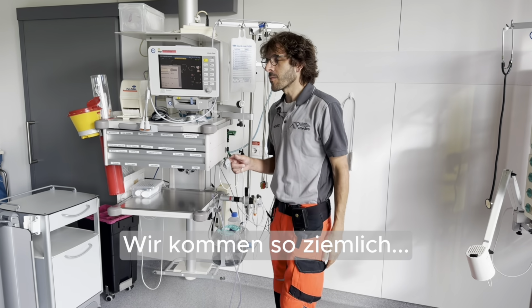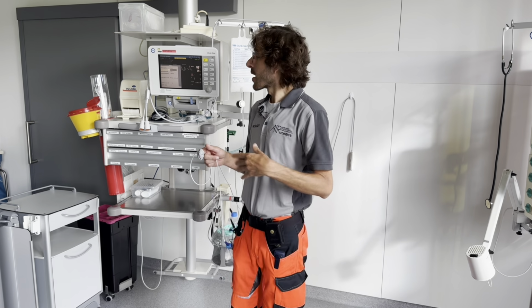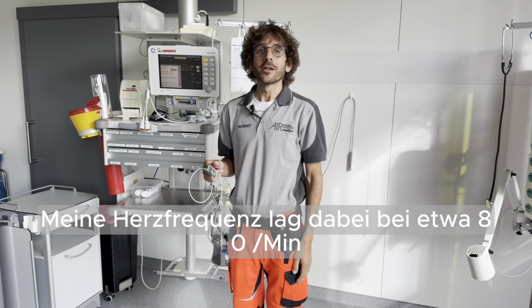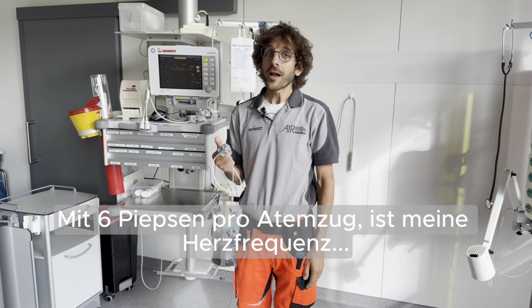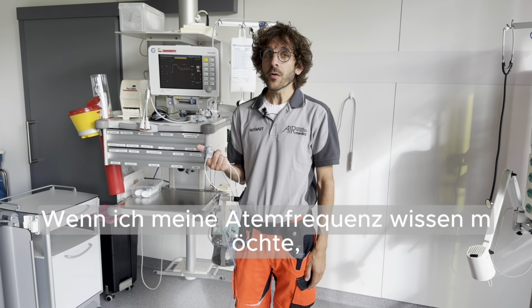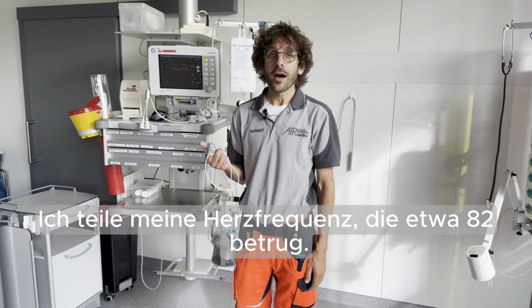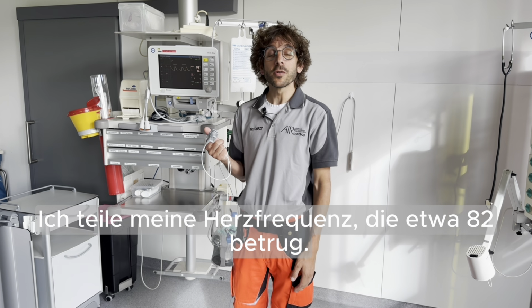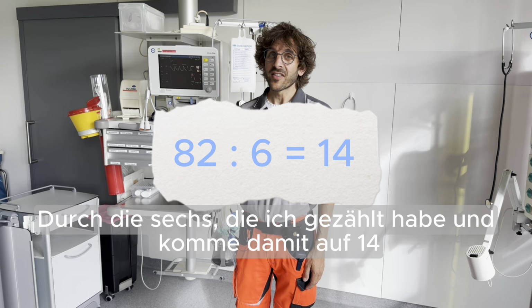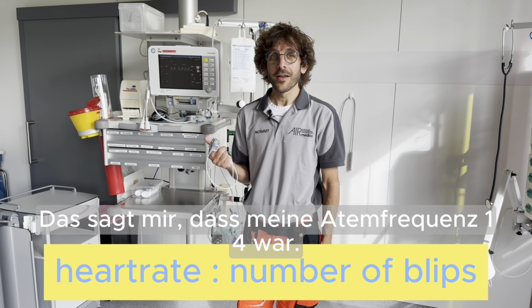So we get pretty much to a count of 6 blips per respiratory cycle. My heart rate was pretty much around 80. So my heart rate is 6 times as fast as my respiratory rate. So if I want to know my respiratory rate, I divide my heart rate, which was about 82, by the 6 I counted, which gets me to 14, which tells me my respiratory rate was 14.